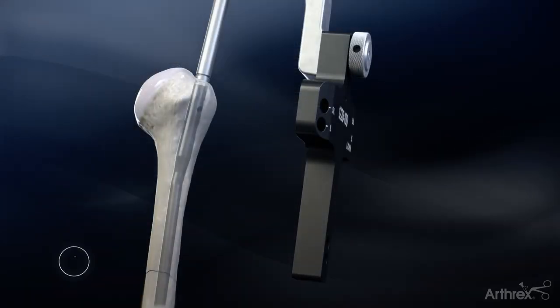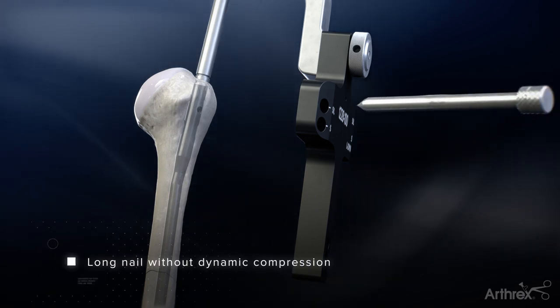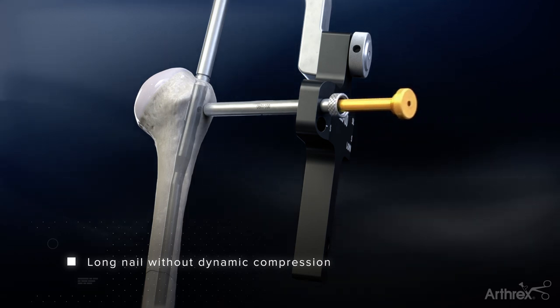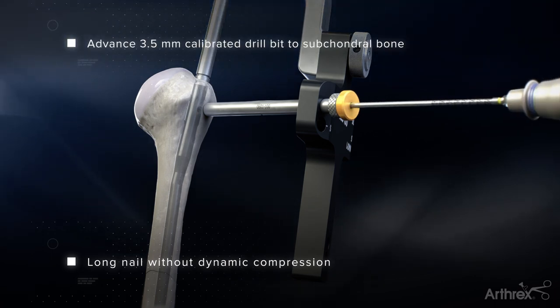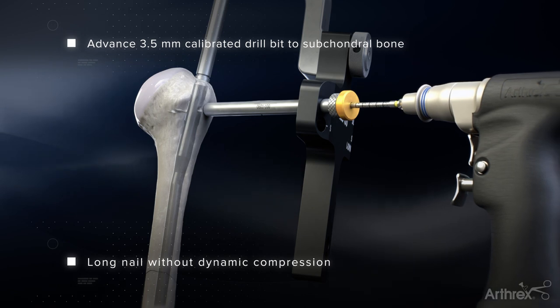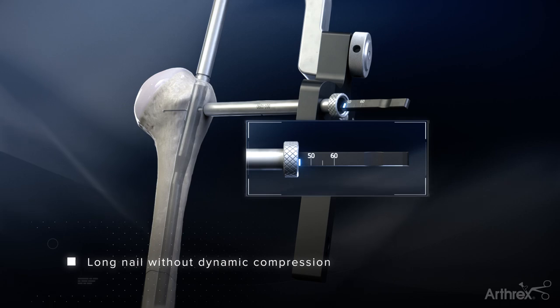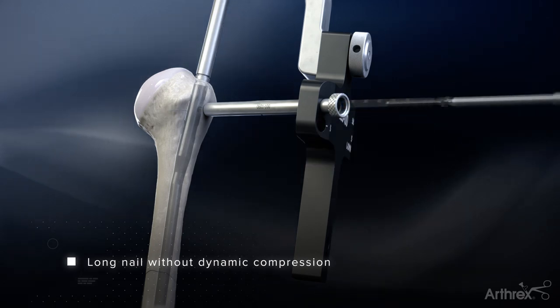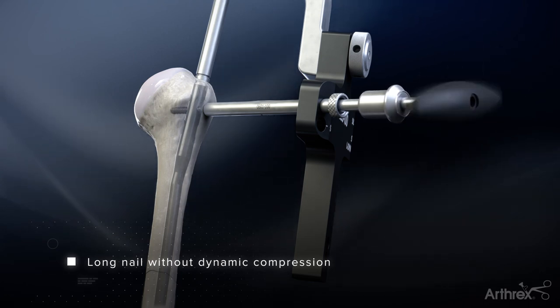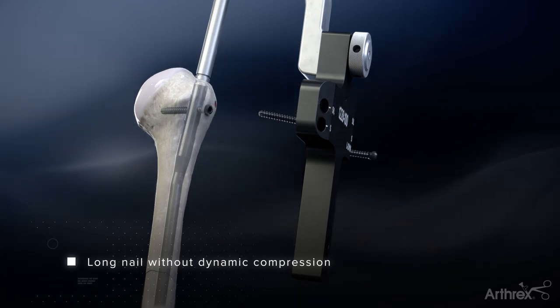If dynamic compression isn't necessary, start with proximal fixation of the nail. Advance the screw sheath and trocar through a stab incision down to the bone. Remove the trocar and thread in the 3.5mm drill sleeve. Advance the 3.5mm drill bit until just inside the subchondral bone. Obtain the screw measurement off calibrations on the drill bit or the hook tip depth gauge. Insert the 5.0mm interlocking screw using the 3.5mm hex driver and T-handle until the head of the screw is flushed to the bone. Repeat the process for the remaining proximal screws.